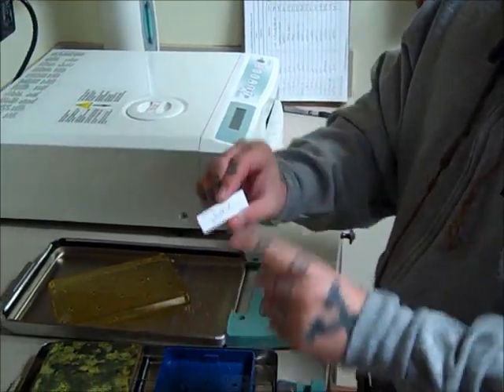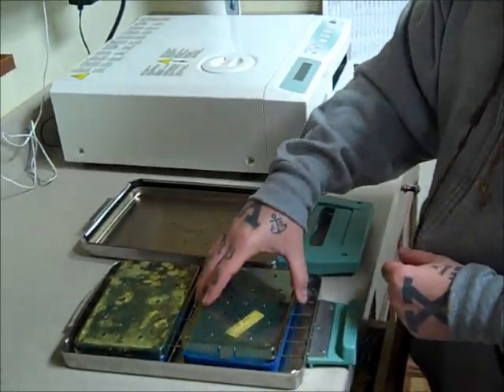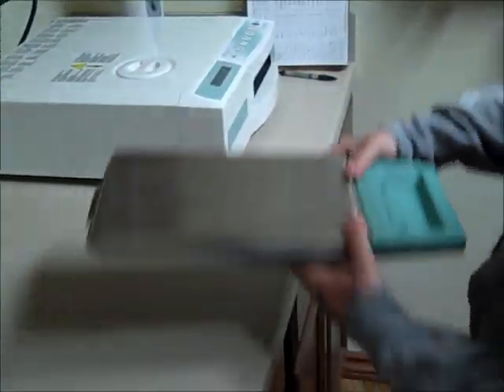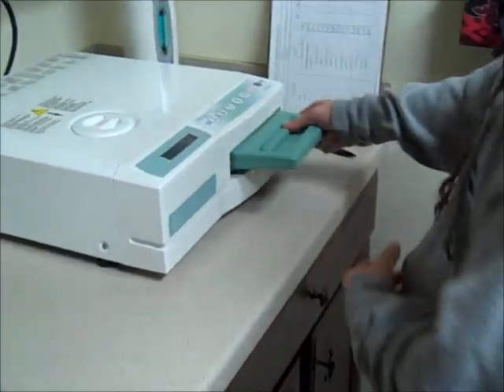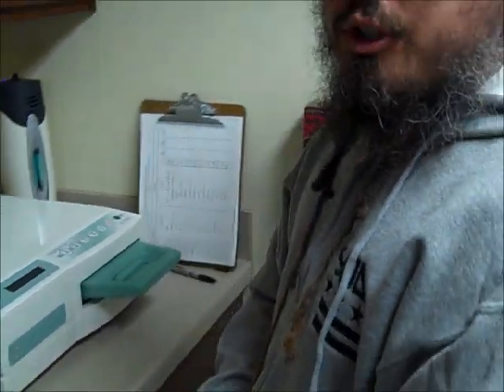So let's see how this works. I'll take the indicator with my name on it and place it inside the little cassette here. In just a few minutes, we'll see if it worked.